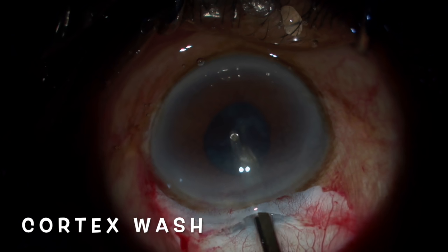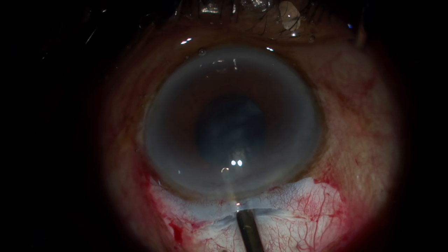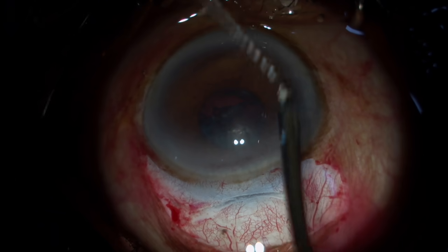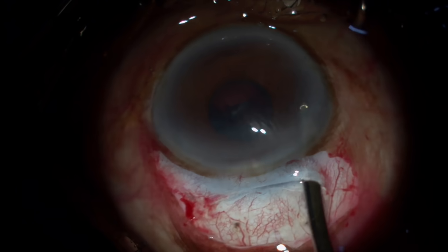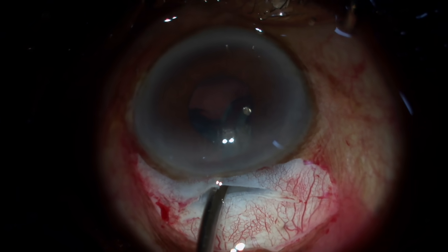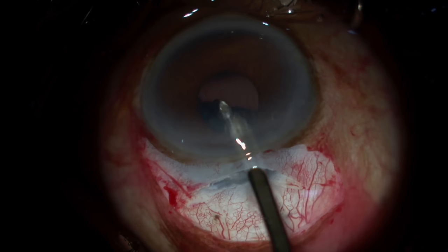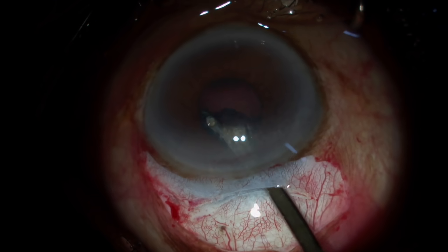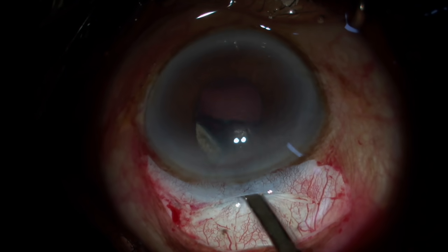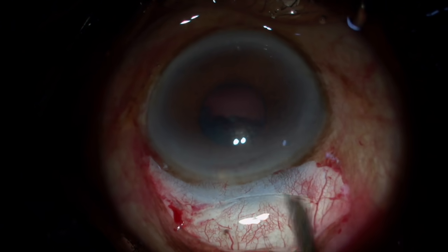Cortex wash is very important. Make sure that you hold the cortex, bring it towards the center, and then aspirate. When wanting to aspirate the sides, don't go to the side of the tunnel — keep it in the center as a fulcrum, just turn so that the tip goes under the iris and pull it in the opposite direction. For example, if you're holding 3 o'clock, pull it towards 9 o'clock and not just towards the outside.